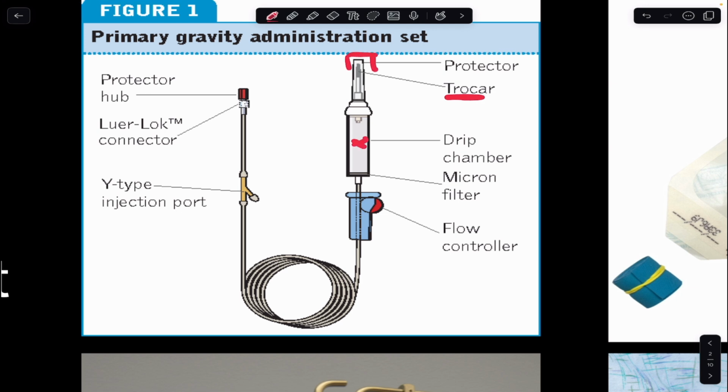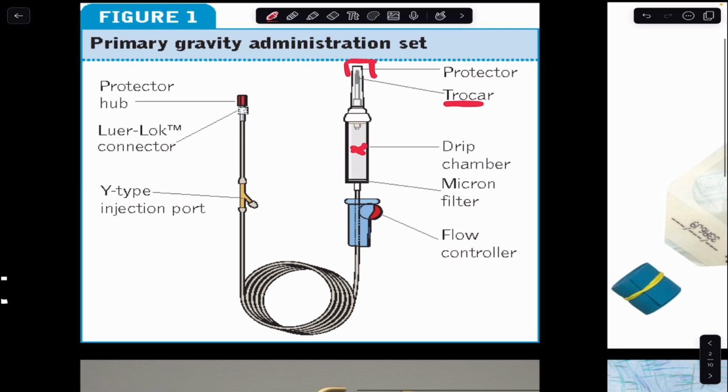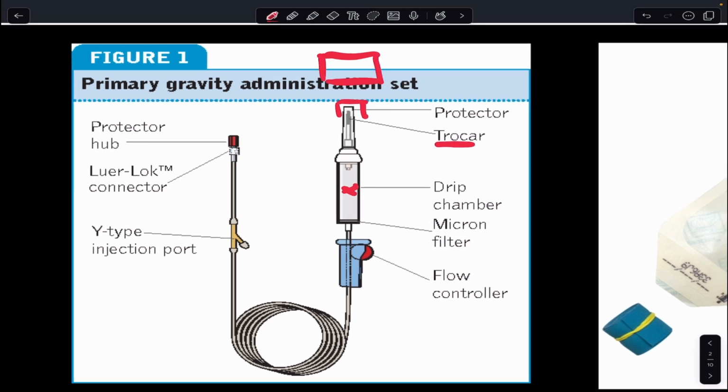A drip chamber here. So your fluid bag would be up here, and then you would have fluid that's dripping into your chamber. It would run down through your line, and then you have a flow controller here with a little dial. So as you slide this dial down, that's going to apply pressure to your tubing and reduce the flow of fluid going through your tubing. You have an injection port over here that you could administer meds through or flush the line through, and then your connector piece and hub that protects that.